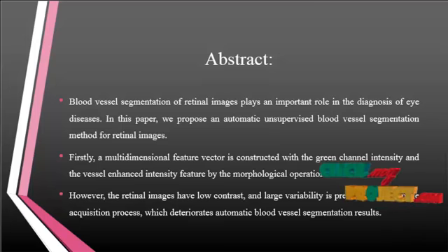In the filter domain, retinal vessels are enhanced by means of multiscale second order Gaussian derivatives, popularly applied to line structures. More precisely, we have the left invariant derivatives, that is the LID frame, and the locally adaptive derivatives, that is the LAD frame. The LAD is adaptive to the local line structures and is found by the analysis of the left invariant Hessian matrix, computed from the LID.